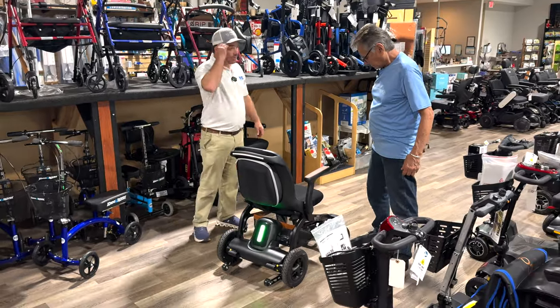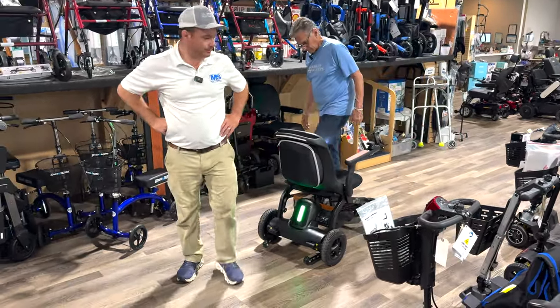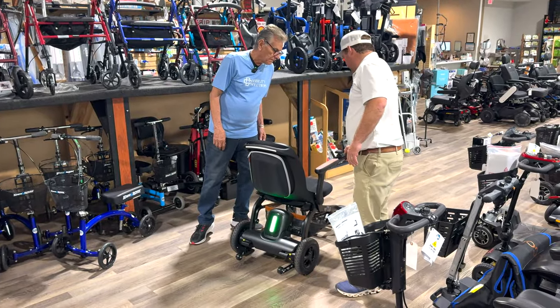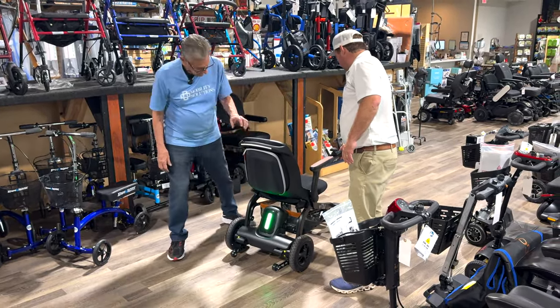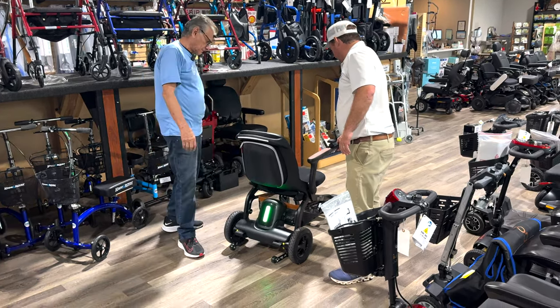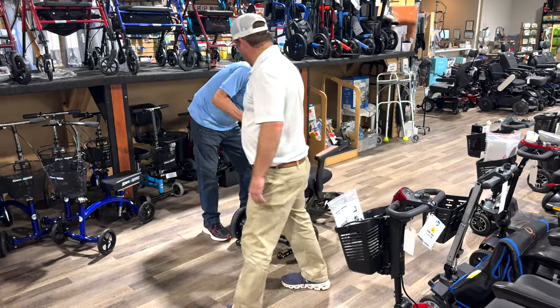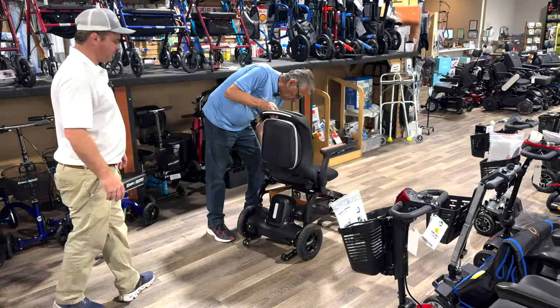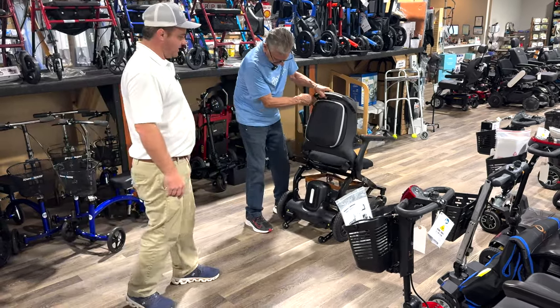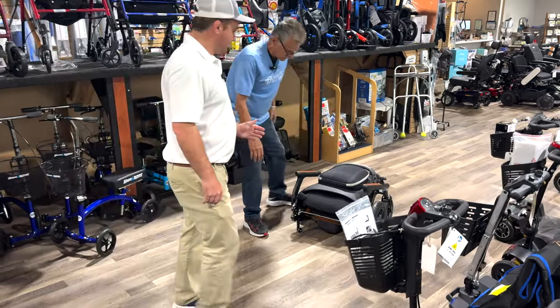So you know how to fold it down? Yes. Lock. Right, let's see if he can fold this down. So turn it off. Yeah, by holding the button. Unlock. So unlock it. Let's turn this thing off. So hold that button. Turn it off. So there's one latch to do. Now go ahead, don't be scared. Don't be scared to do it.